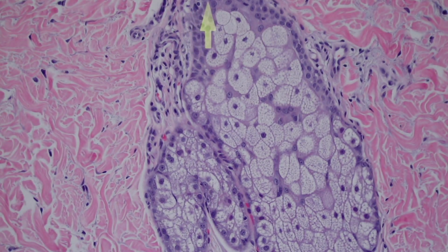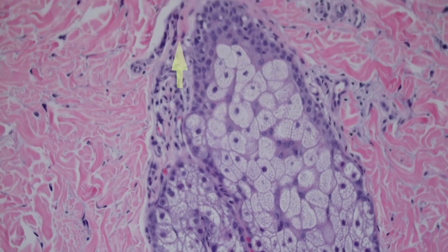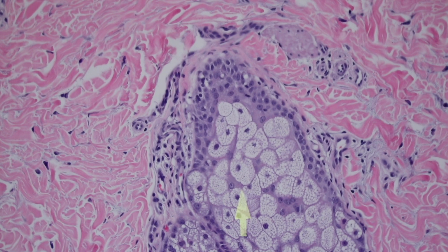And around the outside of the gland, the cells are a little bit more blue and what we call basaloid. So that's kind of what we call the germinative layer. They're like the layer of cells that give rise to the more mature sebocytes. And then as the cells mature, they pick up lipid in their cytoplasm and become more white and bubbly looking. All right, so that's a sebaceous gland.